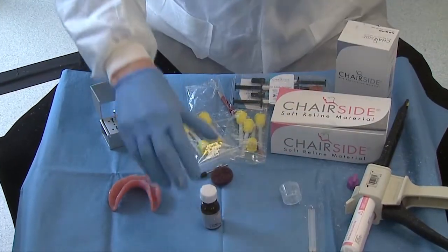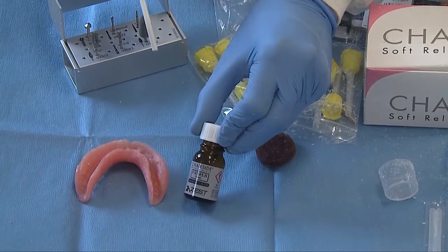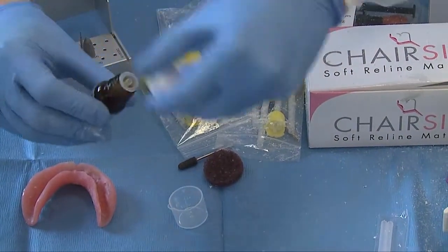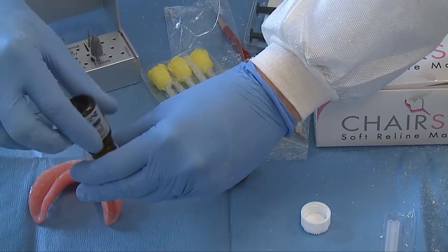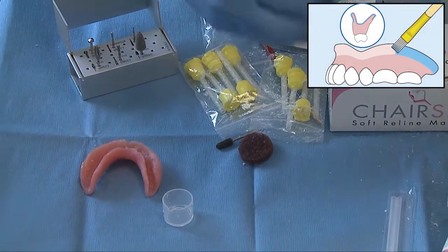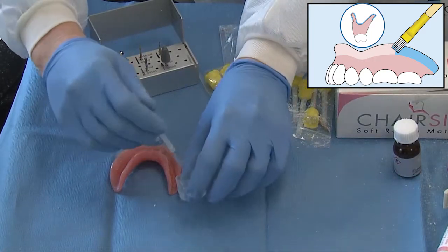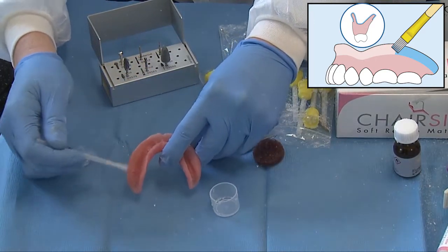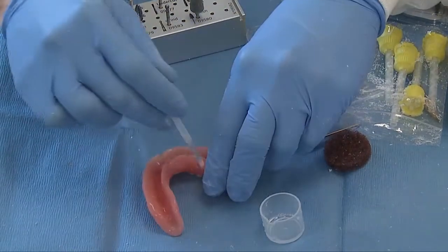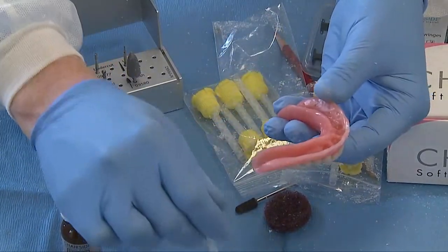What we need to do now is take some of our primer. The primer is inside of this vial right here, and it's going to be used in combination with the entire surface of the denture. I'm going to take a few drops of primer — you don't really need a whole ton of it, use it sparingly. Also included in the Zest kit is a specific brush that works extremely well. We're going to paint along the borders and on the intaglio. This does not require a light cure — it's essentially just a varnish that goes on top of the denture. Just air dry it.